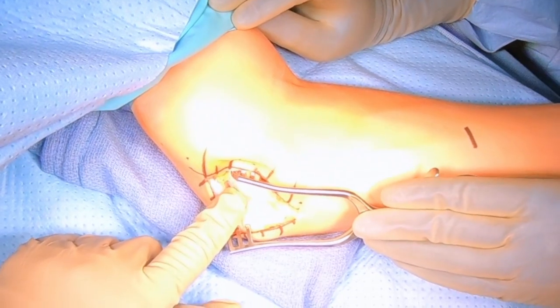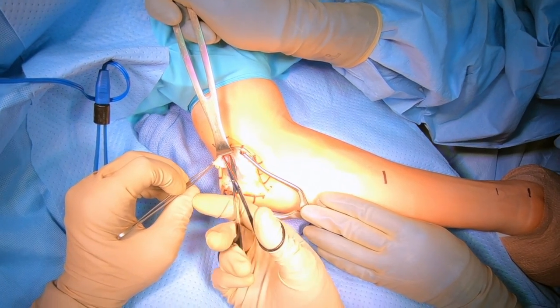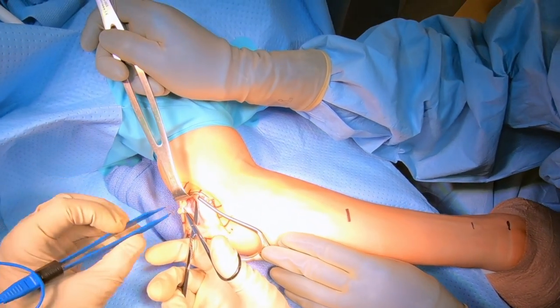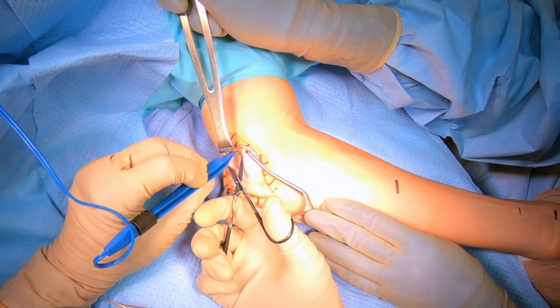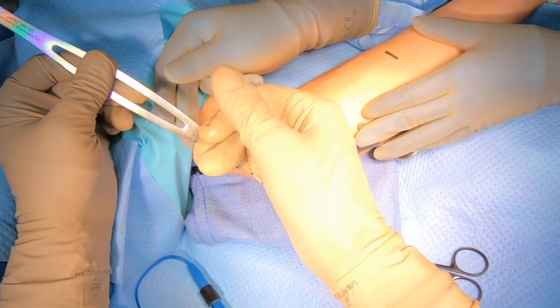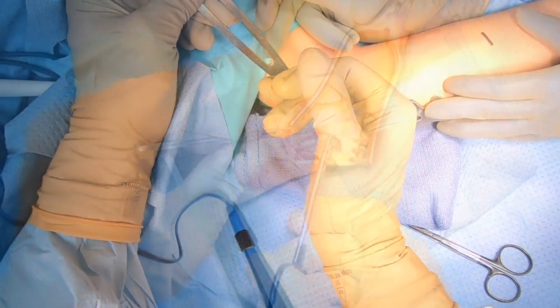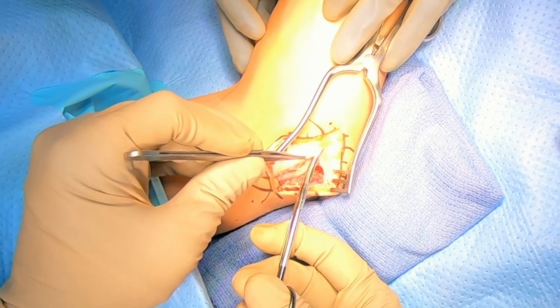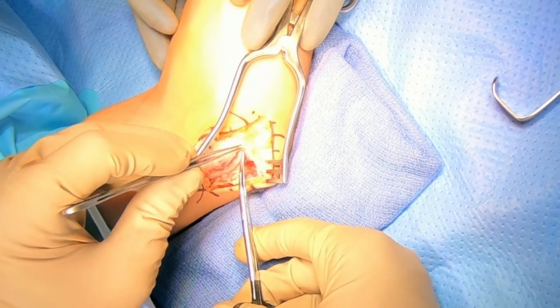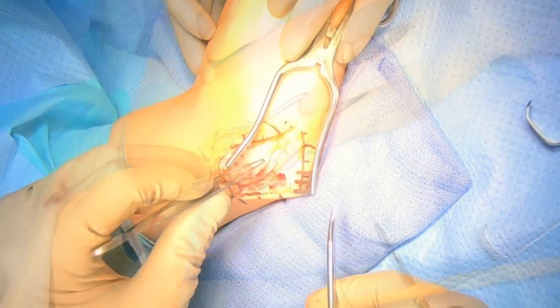You can see me there feeling the nerve and dissecting it out. You see us here working carefully to make sure the nerve is completely freed up all the way up the upper portion of the arm, again using the bipolar cautery to make sure that we get all the blood vessels. You'll see me here use my finger to make sure the nerve is free traveling up the arm. Then we'll continue our dissection around the nerve traveling down into the forearm, carefully dissecting to make sure we don't injure that nerve so we can move it out of harm's way.